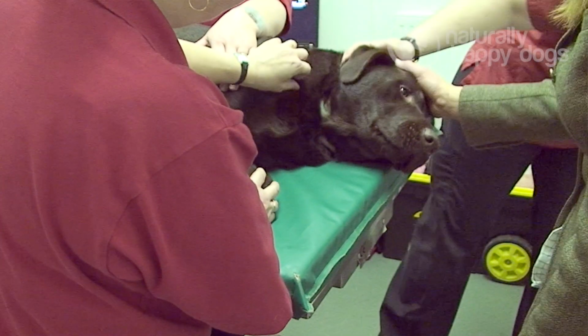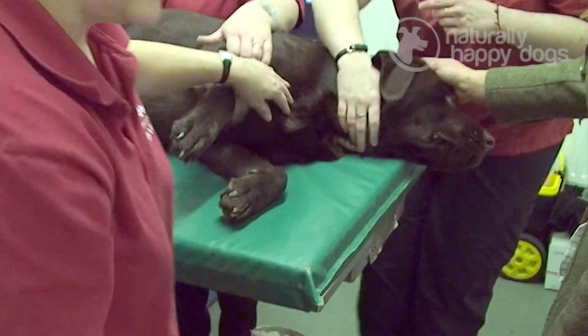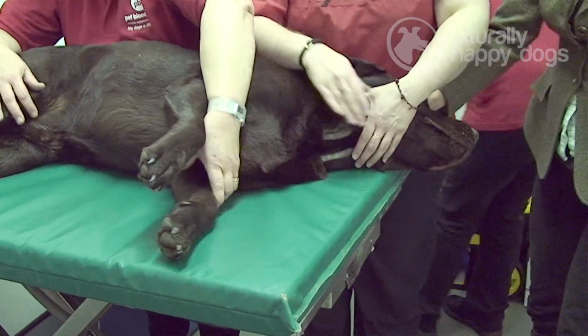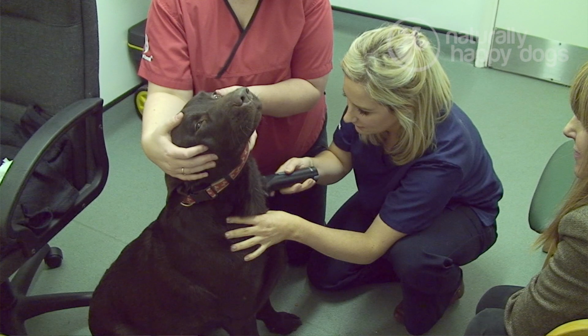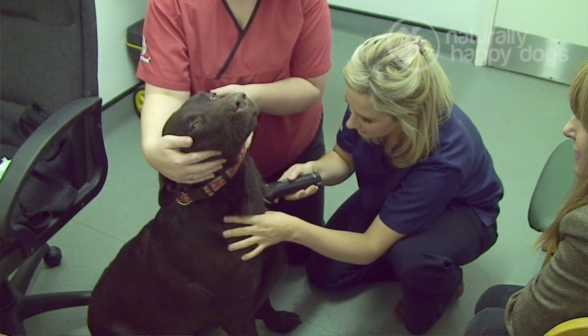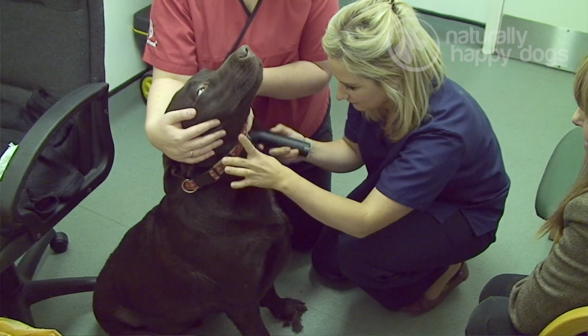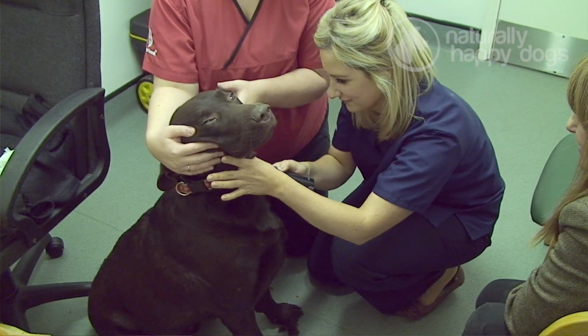We always ask owners to be in the room when their dogs are donating, as long as owners don't have a needle phobia. We don't have any of our doggy donors with needle phobias, it tends to be their owners. So there is always a chair available if owners are feeling a little bit queasy at the sight of a needle. We do remove a small amount of hair over the jugular vein, which is the vein on the neck, and clean that area before inserting the needle to take the blood.